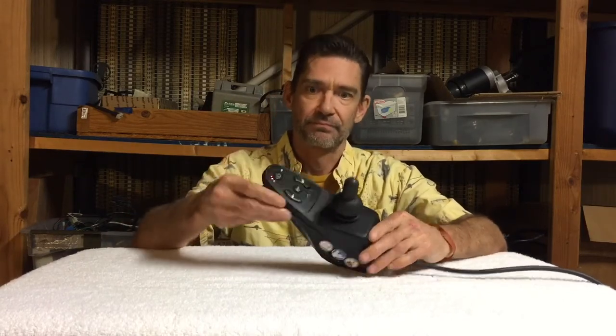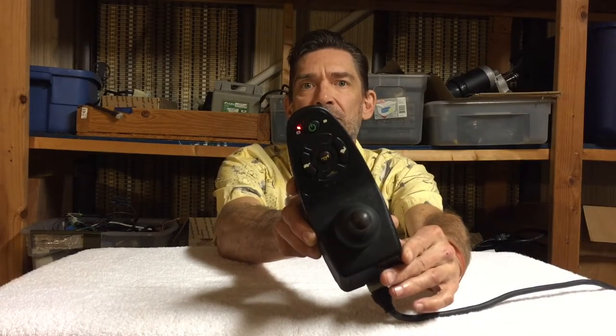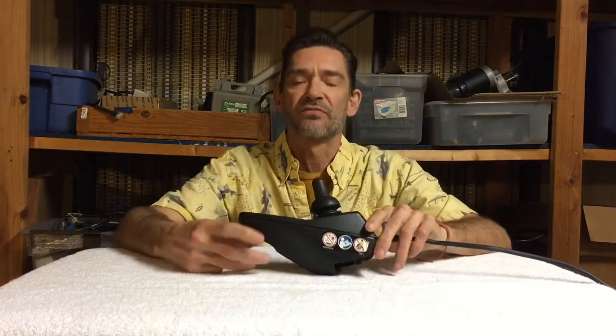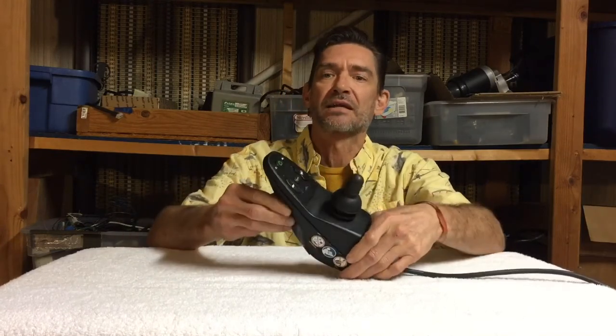This one already has lock mode set on it. So if you see anything that looks like this when you turn yours on - if yours does that - then you accidentally locked it. It probably just shut itself off. This is how you unlock it in case you accidentally lock it, and I'll tell you how you accidentally locked it right after I show you how to turn the lock mode off.